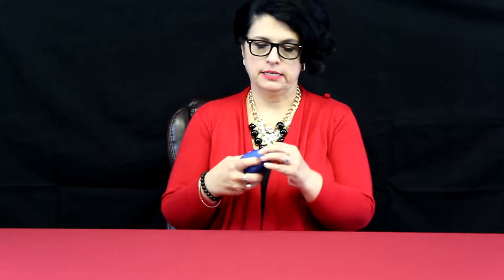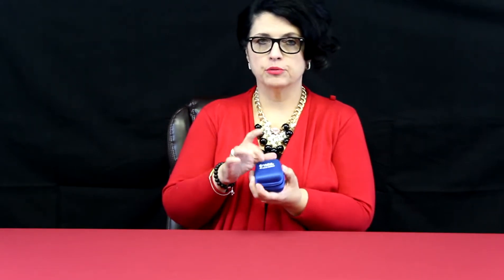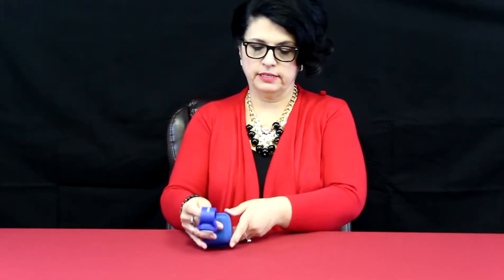This is the Practi CRM. It is a wearable device, and it comes in this cool little blue case. Pretty durable little case, which is nice to protect this little feedback device. This is a wearable feedback device.